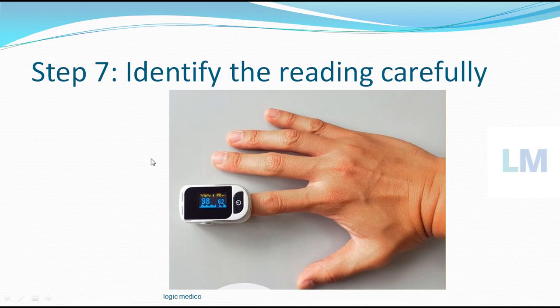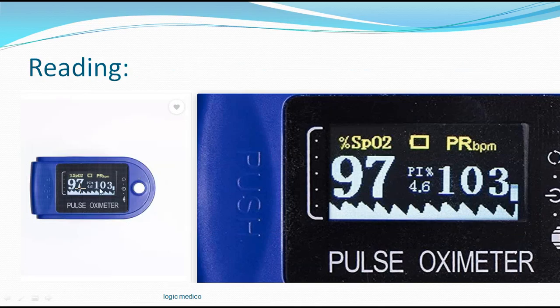Identify the reading carefully. For 5 seconds it should be stable. The pulse rate is mentioned as PR, which measures your heart rate, and this is your saturation of oxygen — showing 98% saturation. In the enlarged view, SpO2 means saturation of oxygen, shown as 97 here. There is also a pulse wave, the pulse rate in beats per minute, and the battery status. If the heart rate is showing high, maybe the patient has not kept the hand still or has not rested the hand for 5 minutes — that is why the pulse rate shows high, because they are anxious or moving the hand repeatedly.